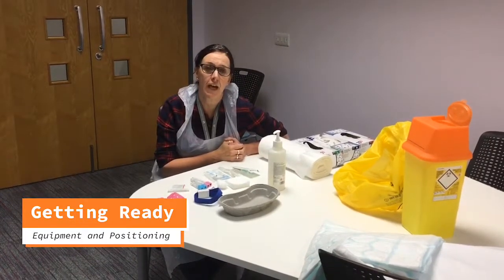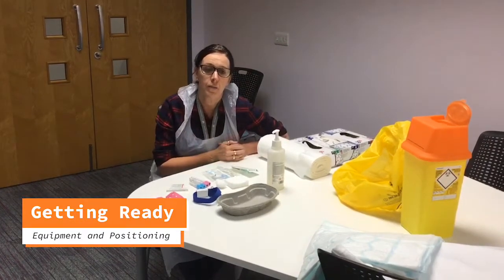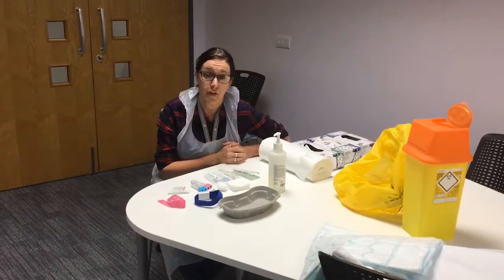Right, hi. What we're doing here is recording venipuncture and cannulations. This is the first part, talking about the equipment that you need for venipuncture.